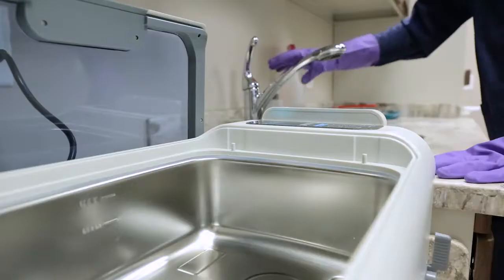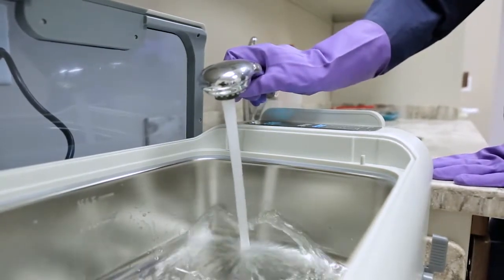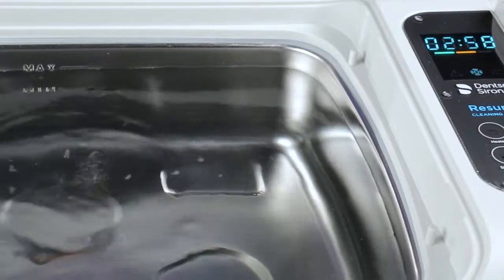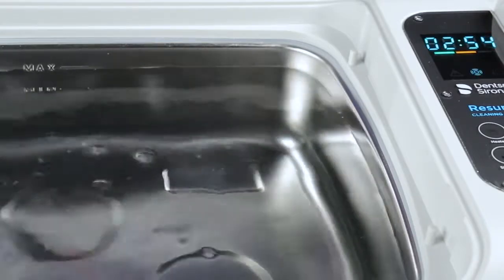Fill the Resurge Ultrasonic Cleaner with fresh water to the minimum fill line. Add Resurge Instrument Cleaner as directed in the instructions for use. Prior to using the bath for the first time during the day, it is critical that you degas the bath.